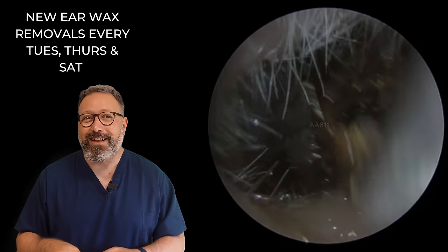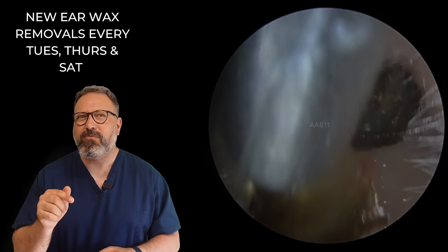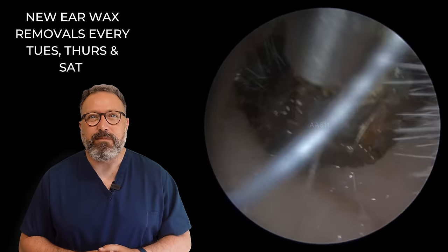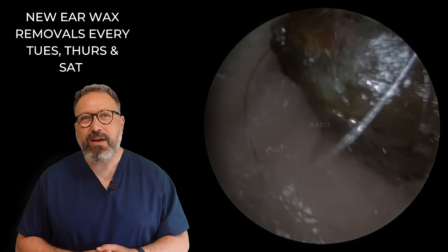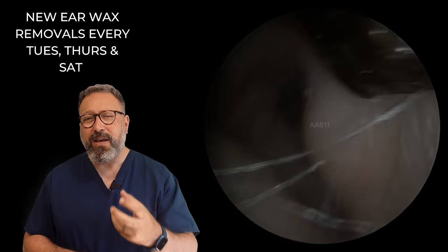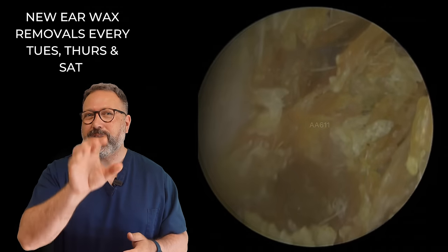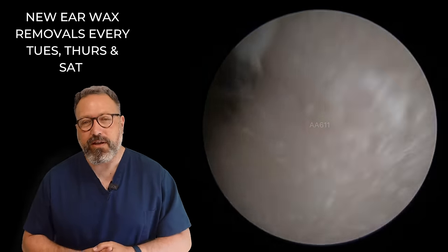Now for the second ear canal, we do throw everything at it — I think we use every single instrument on the second ear canal to get that one clear. But you can see on this first one, it's really starting to break down much more easily. Got this last plug to maneuver out — a little bit of a wiggle to help it on its way. And you can see a very, very hardened piece of wax. Wax doesn't form that deep in the ear canal, so I do think there was probably a little bit of Q-tip use just to push it in. You can see all that dead skin material at the entrance looking much clearer now.